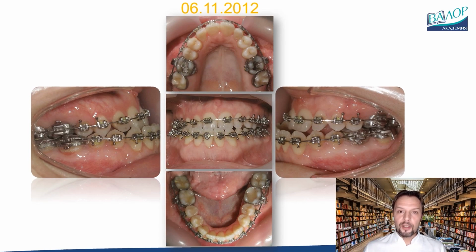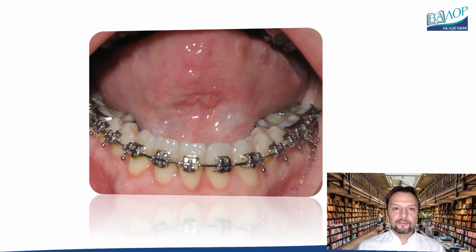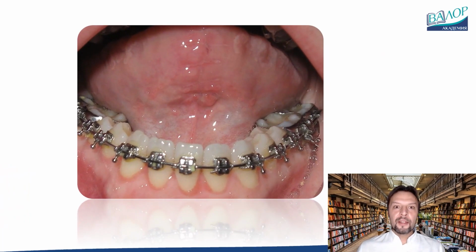The reversed overjet reflects the difference in the lower and upper jaw base. The spacing in the maxillary dental arch is also solved. In the photo below, the impressions of teeth on the tongue are noticeable, as a symptom of macroglossia. The next step is a surgical correction of the tongue, to reduce its volume as a prevention from relapse in expansion of the mandible.